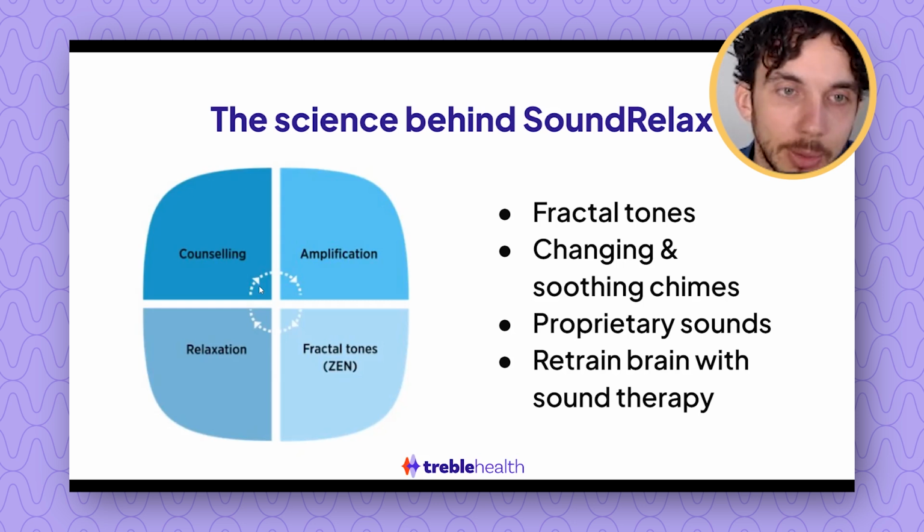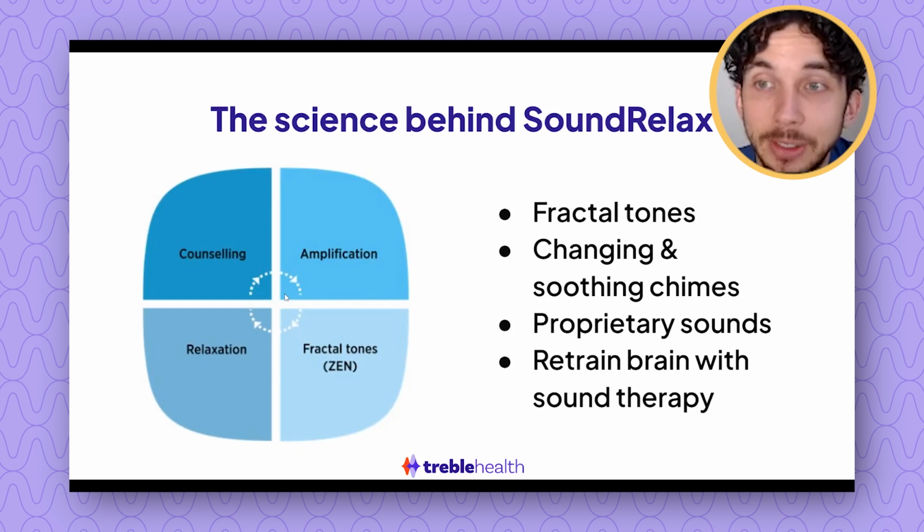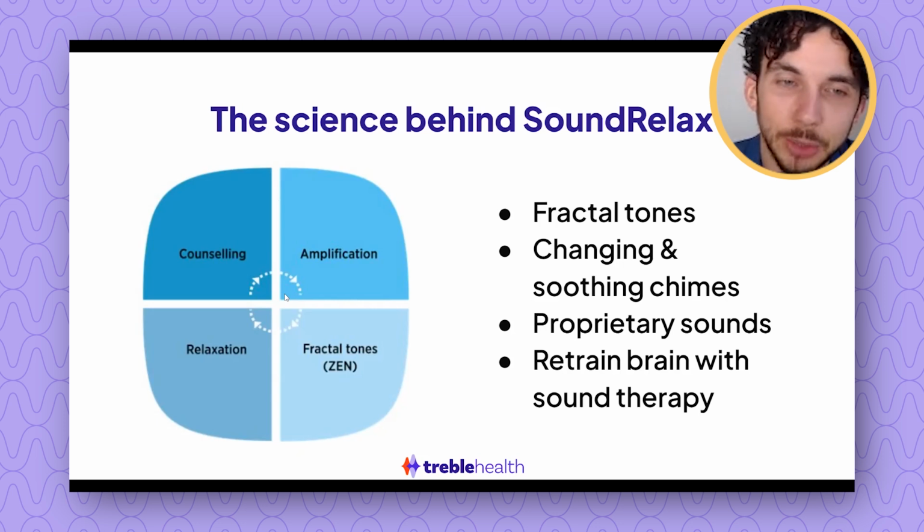And then finally, in the top right, for individuals who do have some hearing loss, which the hearing test would have shown us, hey, there may have been some hearing loss on the hearing test. For those individuals, we can program these Widex tinnitus maskers as hearing aids as well. And a hearing aid gives some amplification of sound that you otherwise were not hearing. So the amplification piece is something key that I do not want our patients to forget about either.